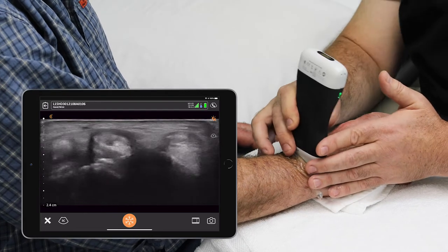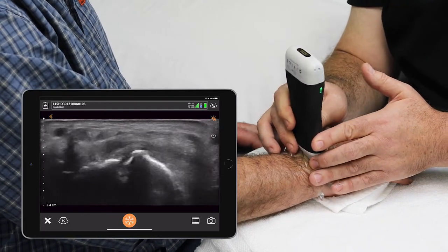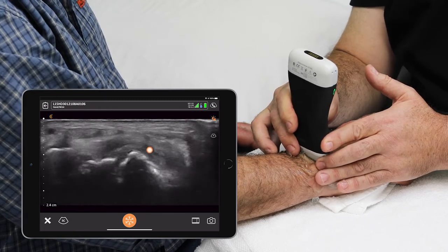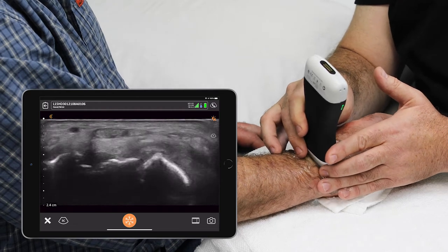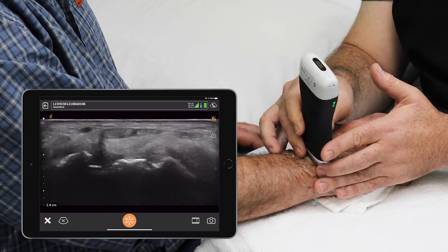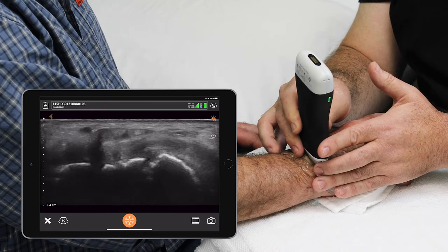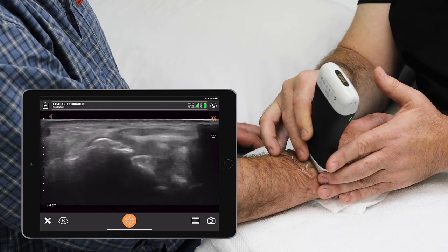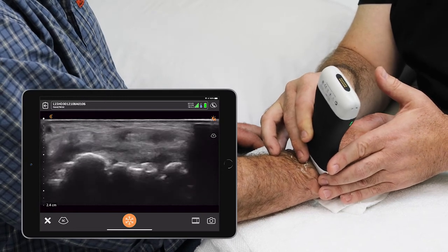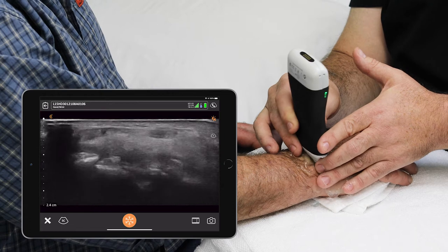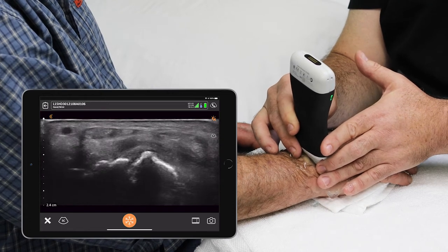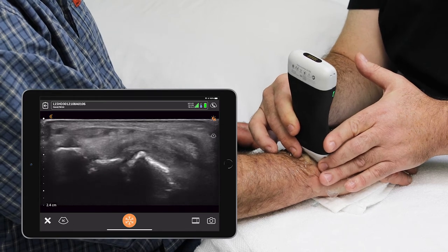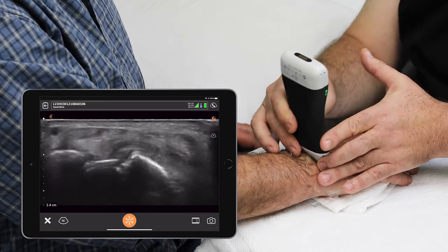Now going more distal, I'm going to take a look at the scapholunate ligament. The topography of these carpal bones is showing such hills, valleys, and potholes — this is the definition of wrist osteoarthritis. But we are seeing at the center of the screen that his scapholunate ligament is intact and does not show any compromise from this position.